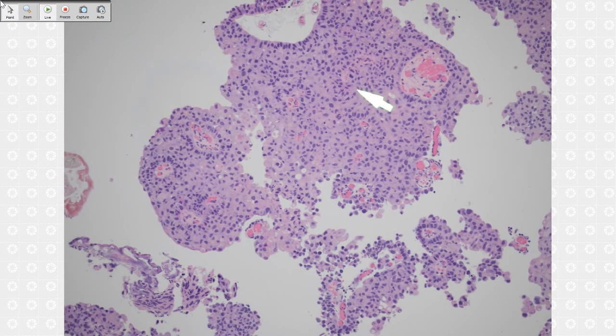Even if non-invasive, I usually call it non-invasive papillary urothelial carcinoma, because urothelial carcinoma in situ, conceptually you have to understand, is a flat lesion, okay? Don't call this one urothelial carcinoma in situ, even though cytologically they are the same high-grade dysplasia, okay? Let's go back.